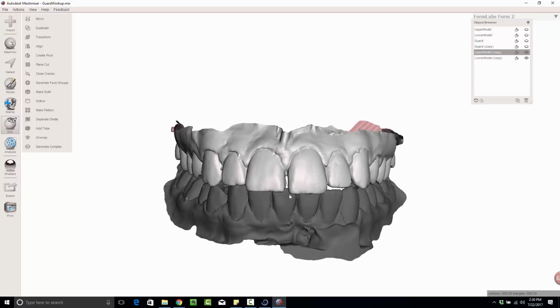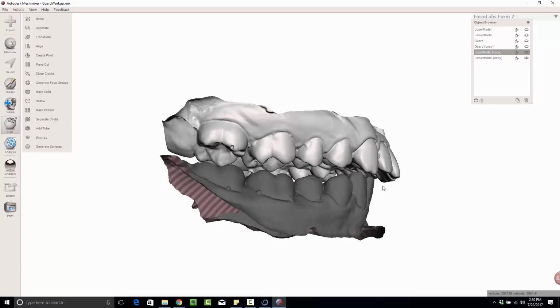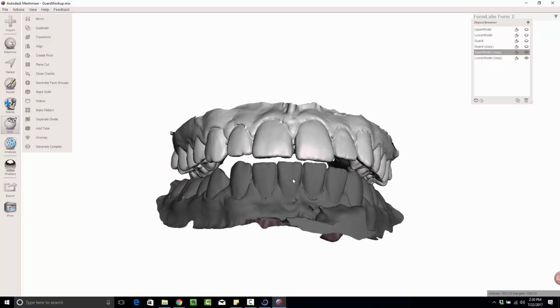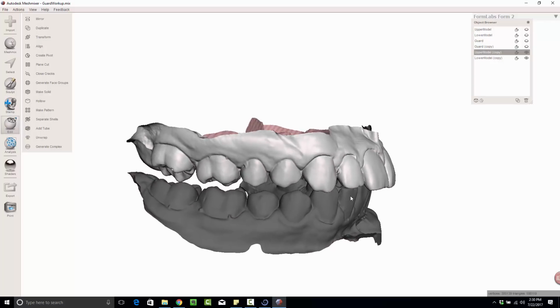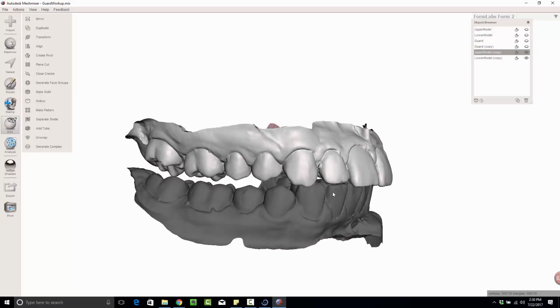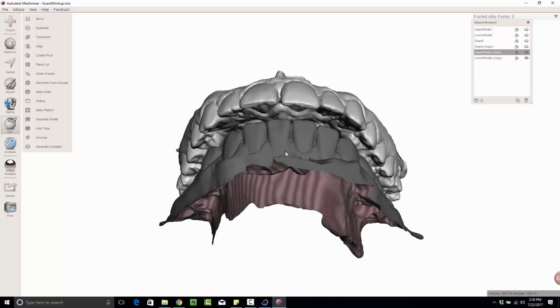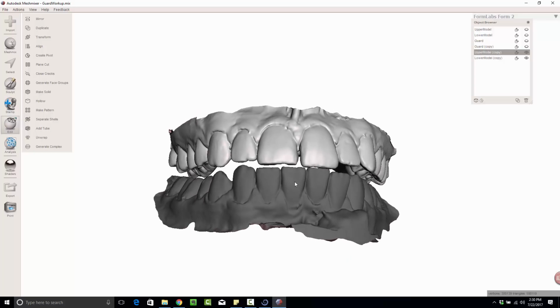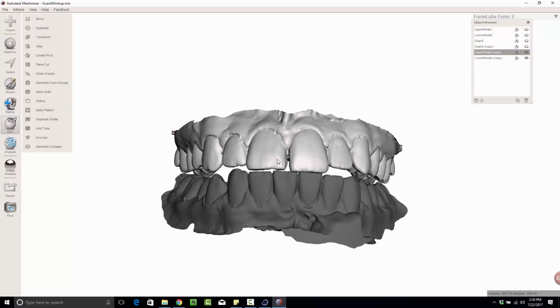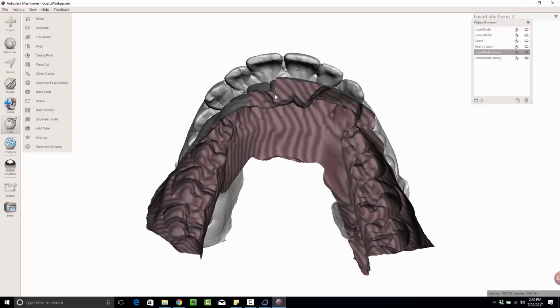That's going to be up to you and what your protocol is on how to obtain the open bite. In our office, we like to use a leaf gauge to deprogram the patient, try to get them in a comfortable centric relation position, and record the bite there. And so when we generate our models and generate the bite, it is all based in that position, because we're hoping to have this patient in CR throughout the night when they wear this guard. Again, that's all about protocols, and your own office protocols and what you're aiming for.